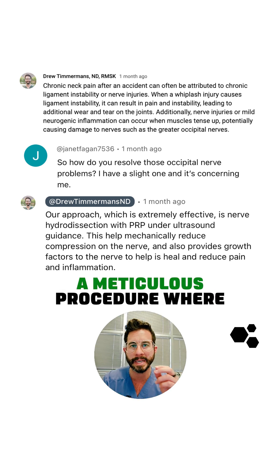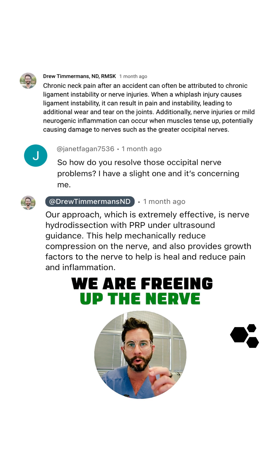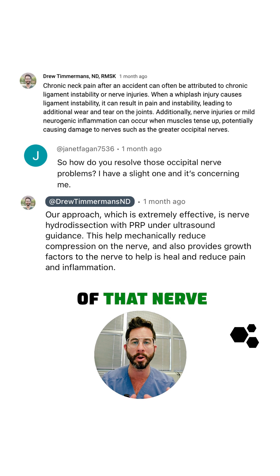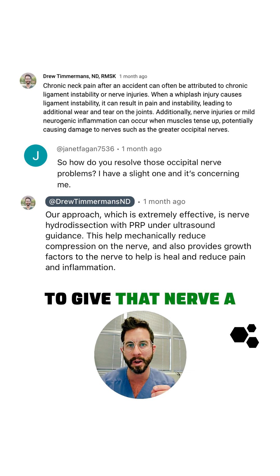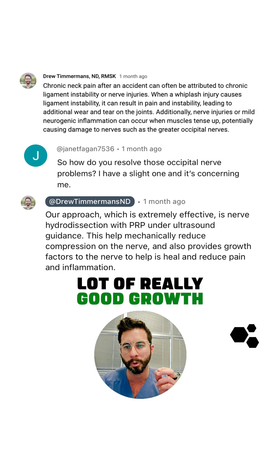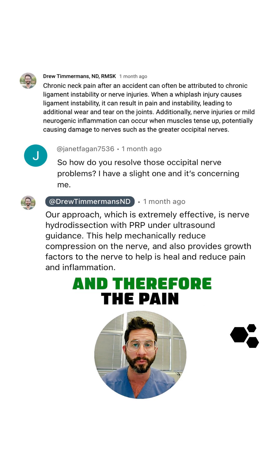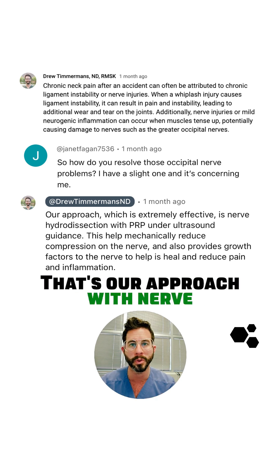This is going to be a meticulous procedure where we are freeing up the nerve from the surrounding fascia. We're going to get a temporary decompression of that nerve, but we're also going to give that nerve a lot of really good growth factors in order to help reduce the inflammation and therefore the pain. That's our approach with nerve hydrodissection.